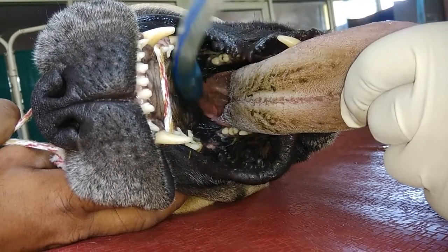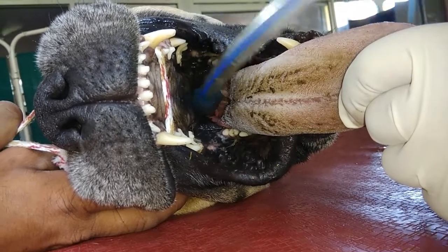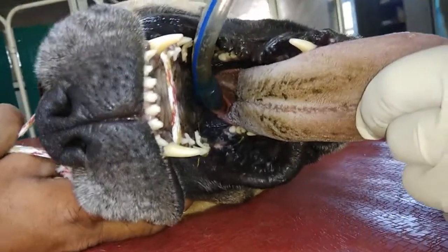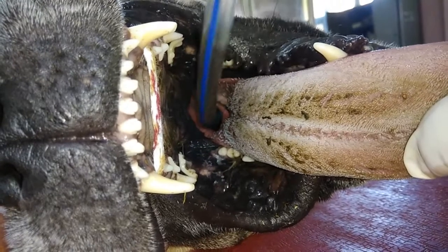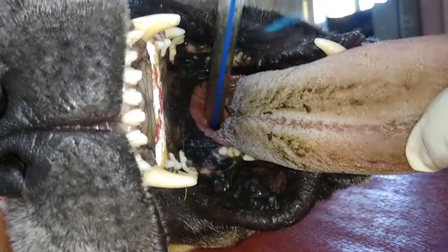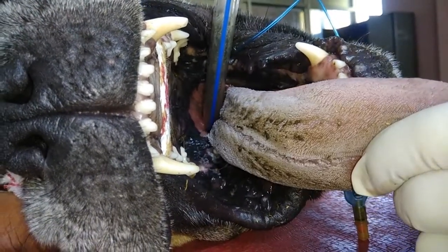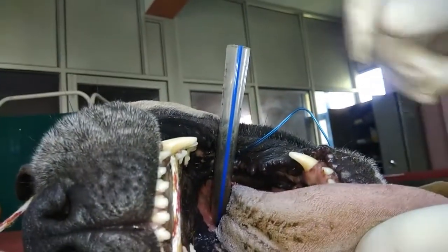Touching the soft palate, we use the tip of the endotracheal tube to press the epiglottis, and then gently insert the endotracheal tube into the trachea. The position of the endotracheal tube itself indicates that it has gone into the trachea, not into the esophagus.